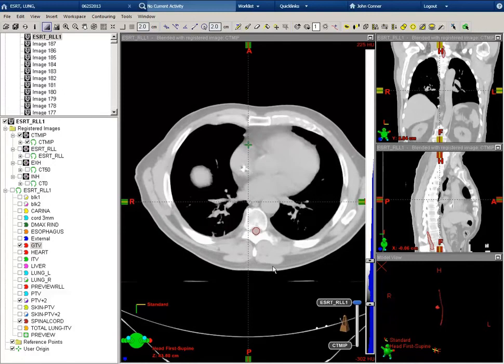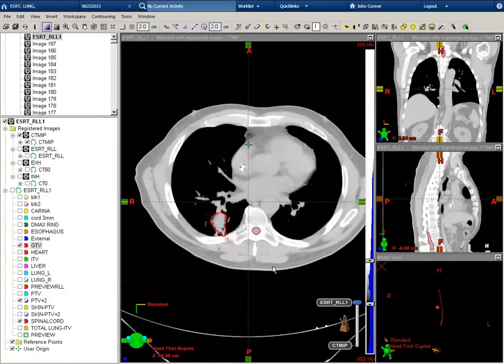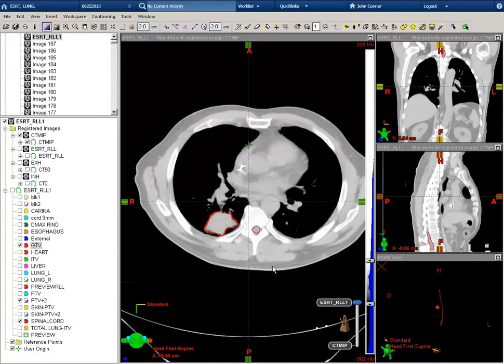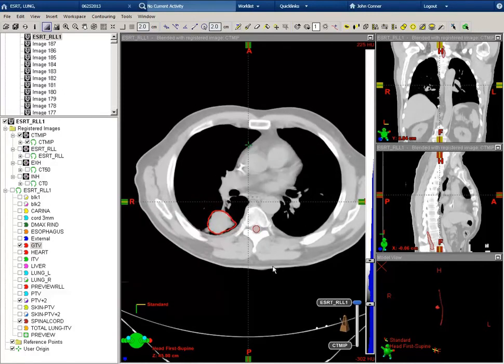The red contour you see here is the GTV, and this was contoured on the free breathing helical scan.